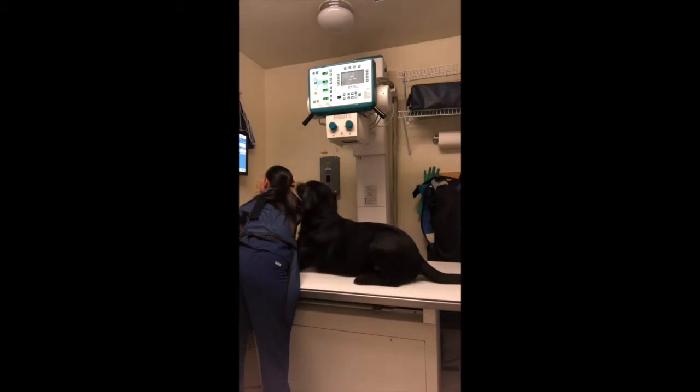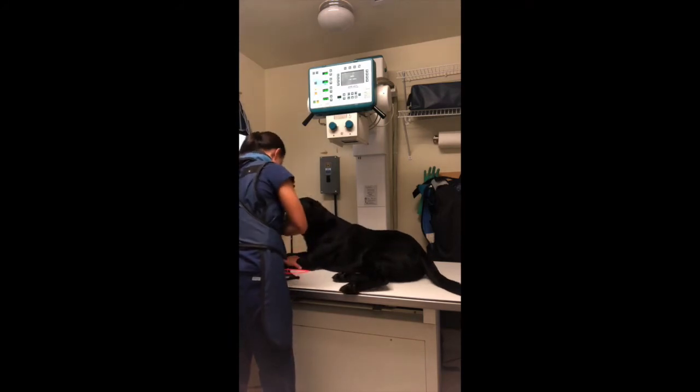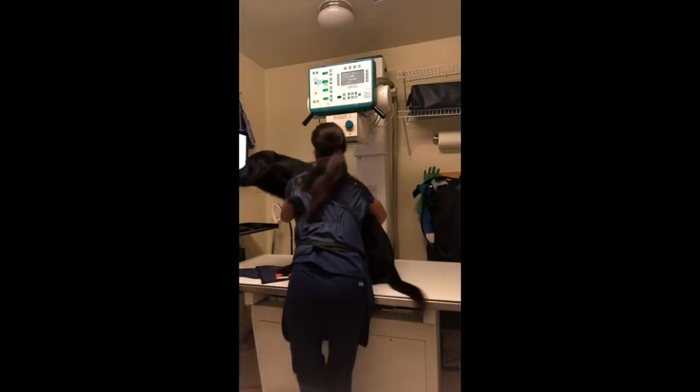On an upper GI barium sulfate study without any food, delayed gastric emptying is diagnosed when gastric emptying is not completed after 3 hours in dogs and 1 hour in cats. Gastric emptying time longer than 8 hours for barium mixed with solid food is considered abnormal.